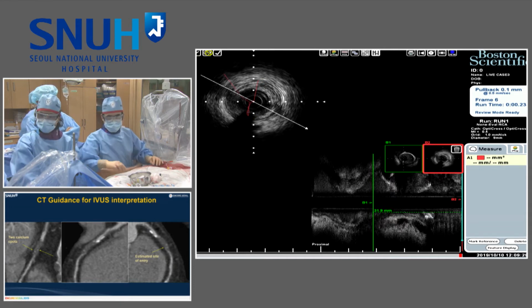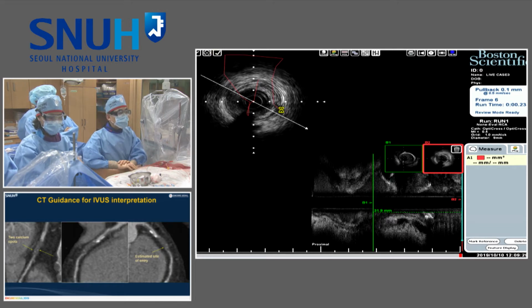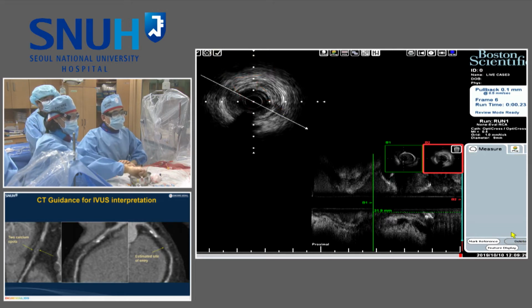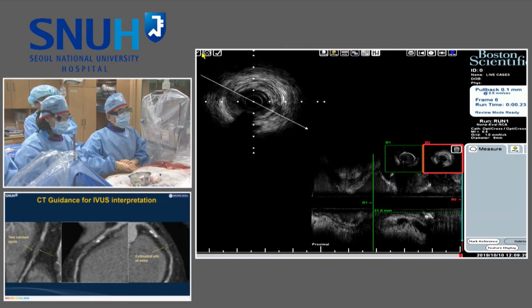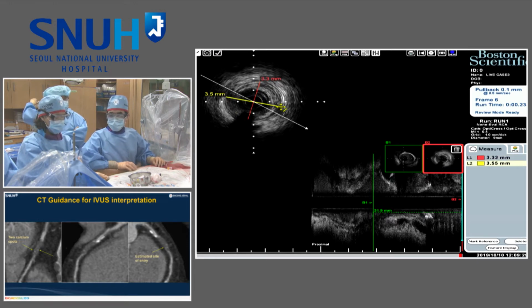카라벨로 가져올까? First I'd like to exchange the stiff wire to soft wire to protect the damage on the PL branch, peripheral PL branch. Thus, first I exchanged the Gaia to the soft wire. 뭐 한다고?